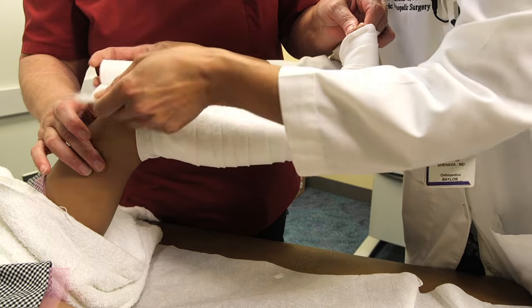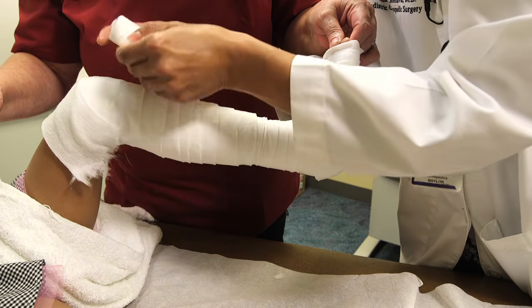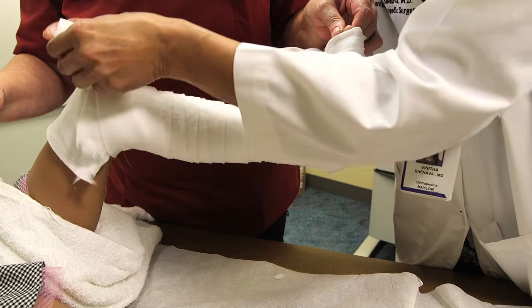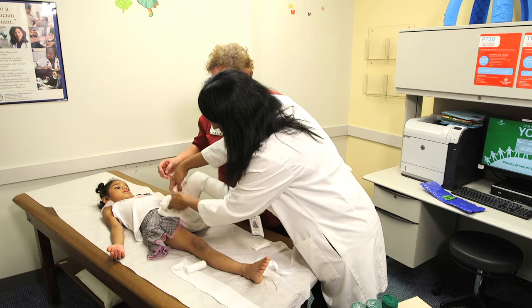The knee, again, is an area where you don't want a lot of padding underneath, but you want more at the front of the knee over the bony prominence. So you're going to put extra padding on top, and then a little bit along the back, again avoiding any wrinkles.